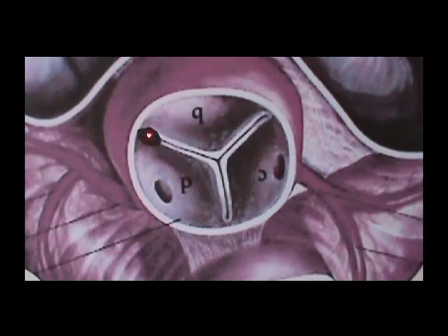You must use the transducer to make tiny movements to interrogate the entire surface of the valve. You angle slightly in one direction and fan slightly, then angle in the reverse direction till the entire valve surface has been covered. This is known as surfing the valve. You could also begin in the center of the valve and make tiny but ever larger circles.